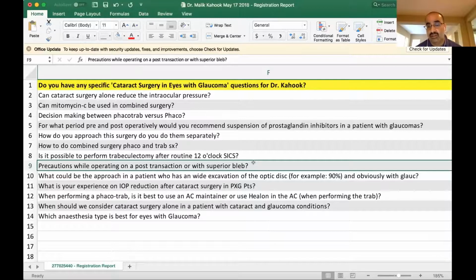That's one thing that you can do to decrease the chances of that superior bleb scarring at the end of cataract surgery, which unfortunately can happen at times when you raise some of the inflammation that can happen after cataract surgery. It could influence your bleb. So doing that procedure with the cyclodialysis spatula will increase flow and potentially allow that bleb to survive much longer.